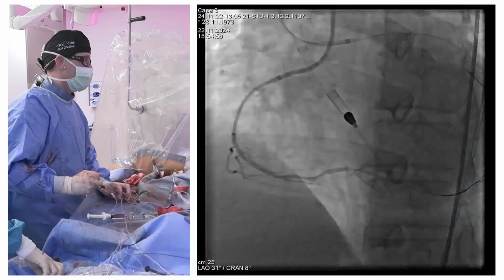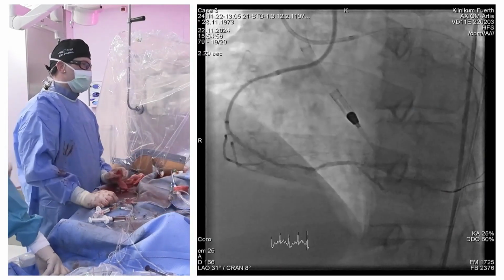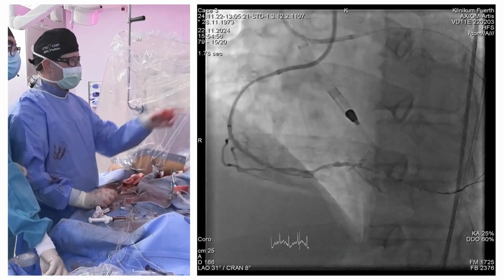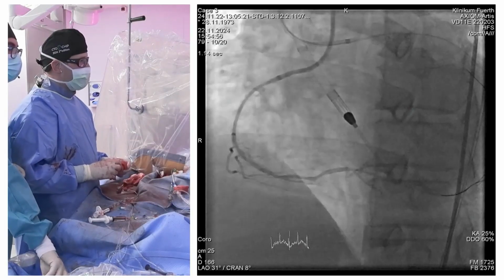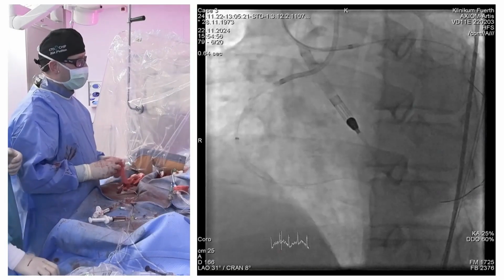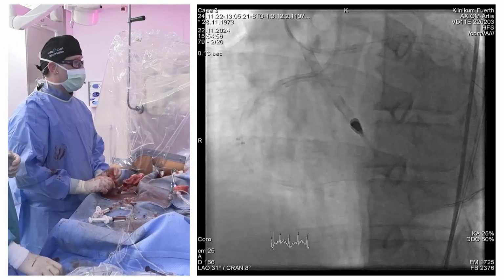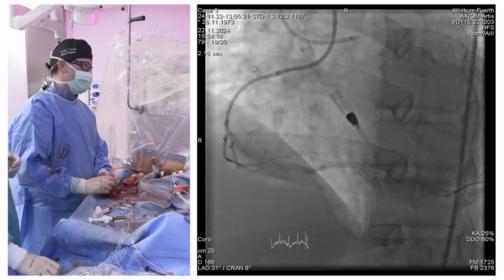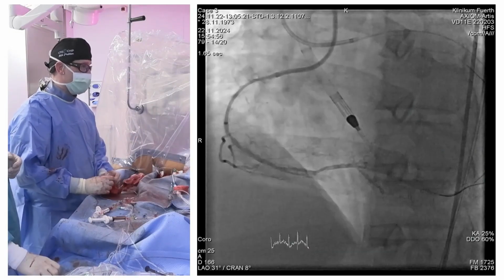So this is where we are right now, which is not too bad, I would say. But especially the ostial stent of the ostial PD has some difficulties. You see down the road where actually we left the stent and had the knuckle before, and of course the reason why we were not able to cross the mid part was that partially collapsed stent from the mid to distal RCA or in the distal RCA.